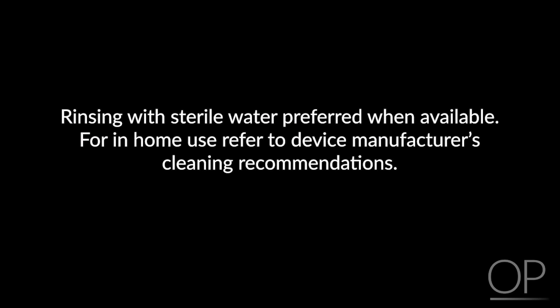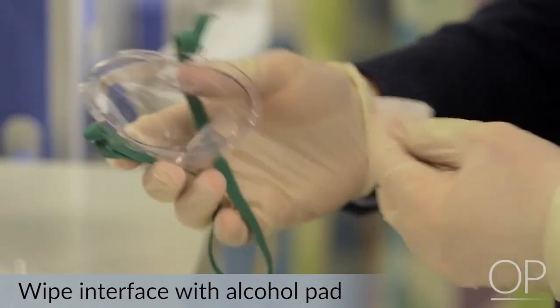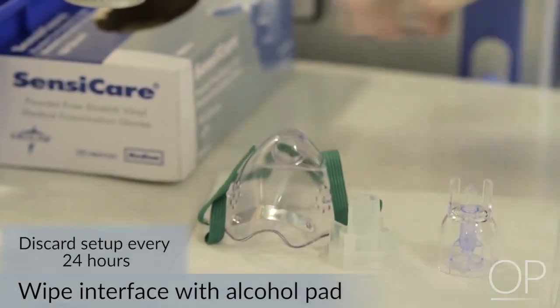Cleaning. For aerosol delivery equipment, including nebulizer and holding chambers, devices should be cleaned and disinfected appropriately. Although there is some controversy in the literature as to the most effective methods of disinfection, the following recommendations are noted by the nebulizer manufacturers, the American Association of Respiratory Care, and the Association for Professionals in Infection Control and Epidemiology. A disposable handheld small volume nebulizer, like the one discussed earlier in this lecture, should be rinsed thoroughly after each use and allowed to completely air dry between treatments. A mask or mouthpiece should be wiped with an alcohol pad. The entire setup should be discarded every 24 hours.